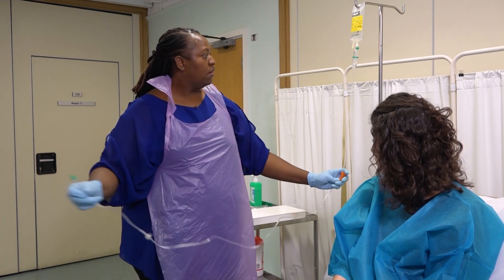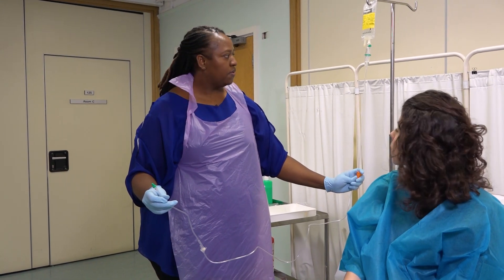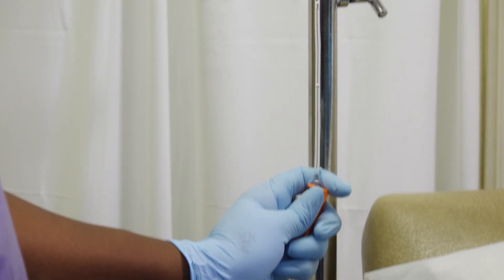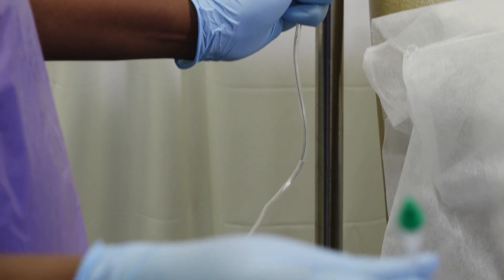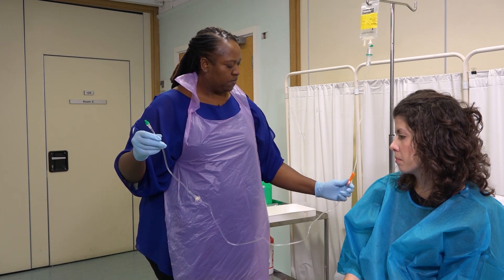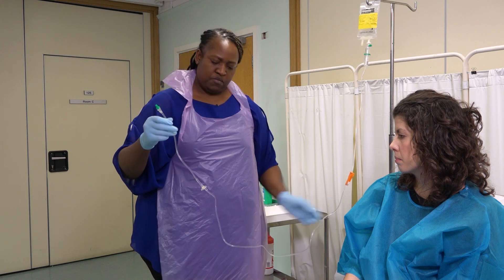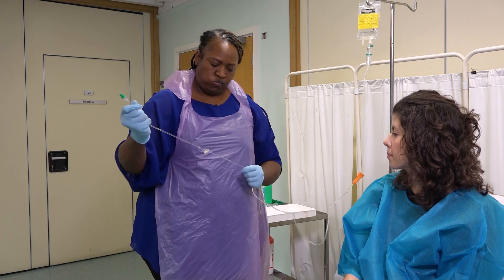Prime the tube with fluid by opening the roller clamp slowly. Allow the fluid to pass slowly along the tube until it reaches the end, then close the clamp. Check for any air bubbles in the tube and remove them if present.